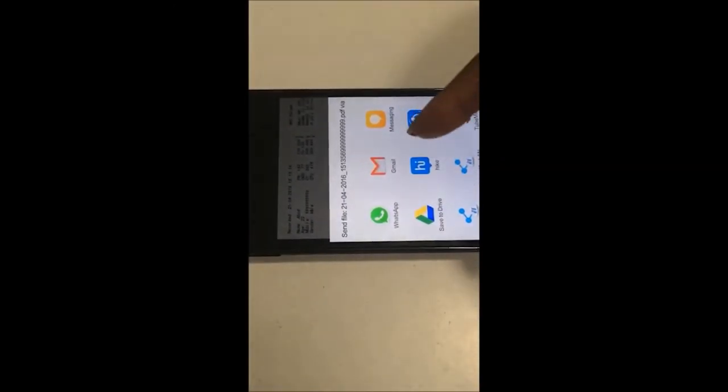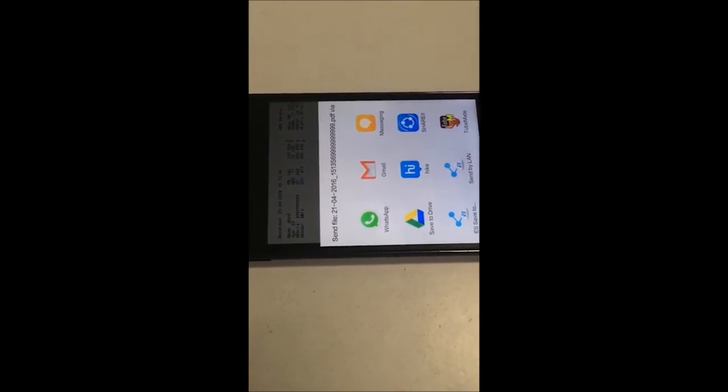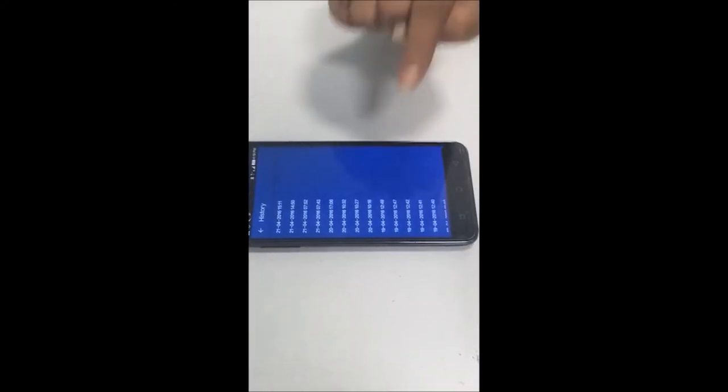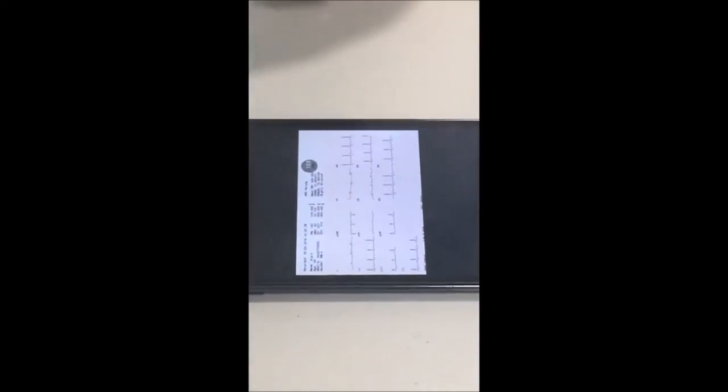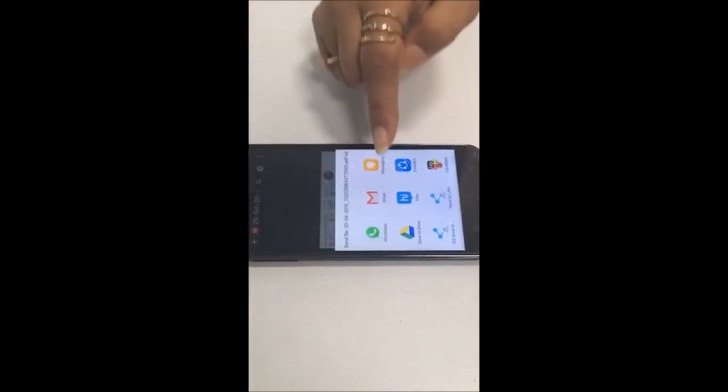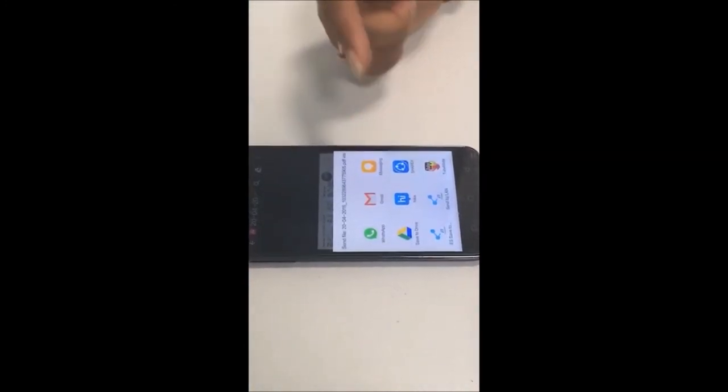Now, to share it, you can send the file through various platforms like WhatsApp, Gmail, any of the one that you prefer. On different dates and times, this is the full 12 lead report that you will get on your smartphone, which you can send to various platforms, whichever you prefer, through WhatsApp or Gmail.